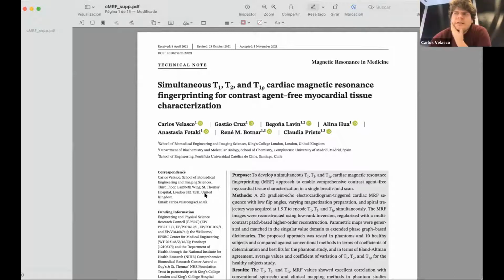Yeah, if I may start here, I would say the easiest way would be to say that these are our normal MRF values and not look at other reference values because they are based on a different technique.